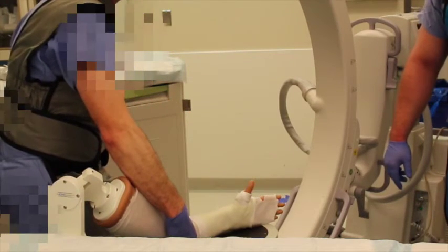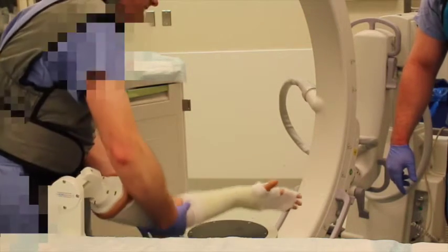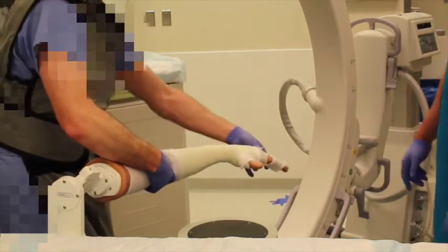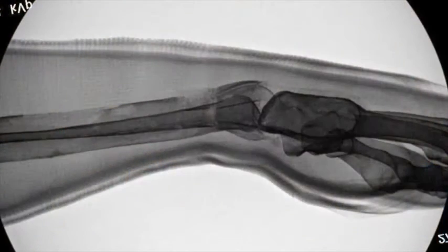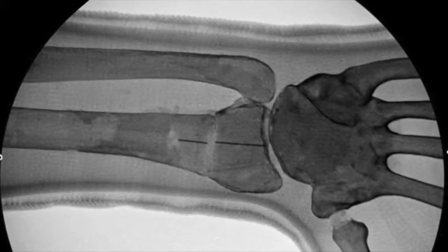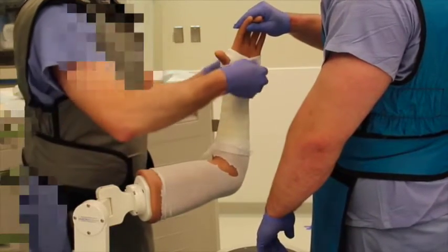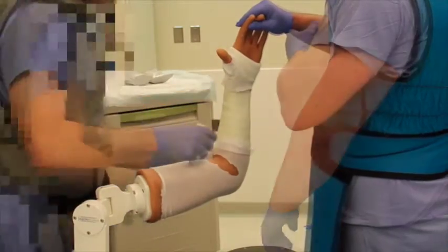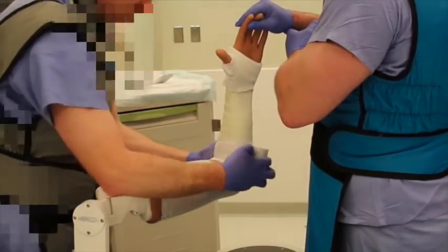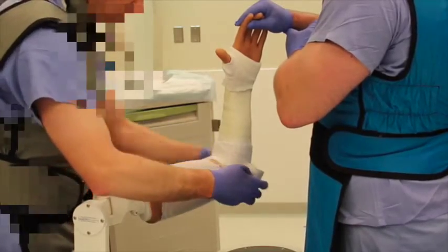Fluoroscopic imaging can be used to confirm reduction of the fracture with the temporary short arm cast. The short arm cast can then be extended to a long arm cast if desired, to help provide additional stabilization to the fracture site.